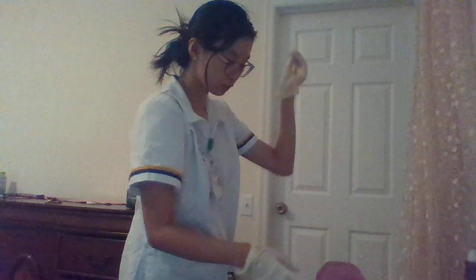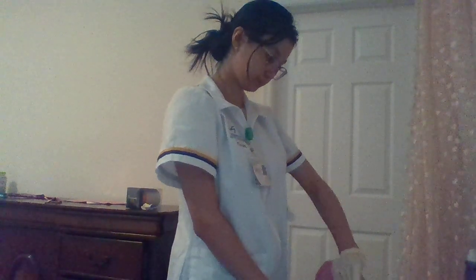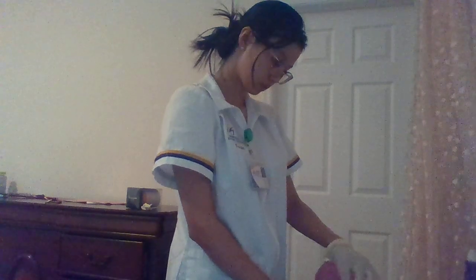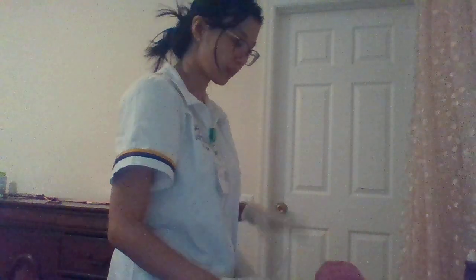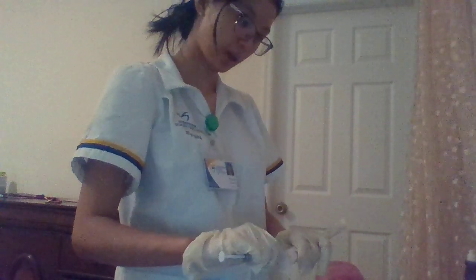I'm gonna use the alcohol wipe to clean the injection site for 30 seconds in a circular motion from center to outward. And I'll allow it to dry, and after that I am gonna give my medication.